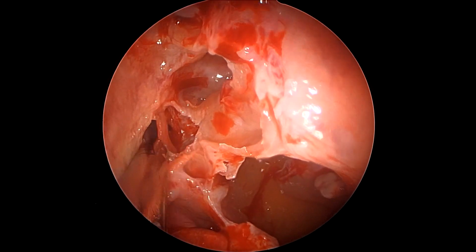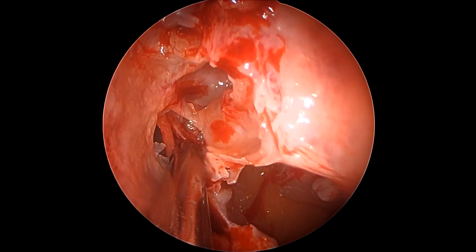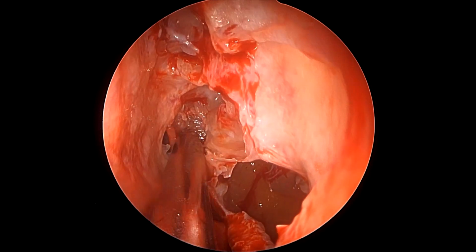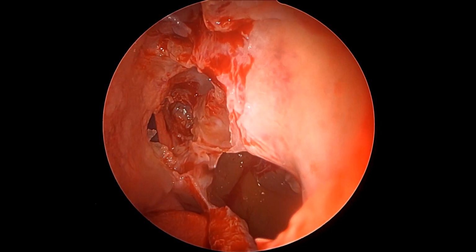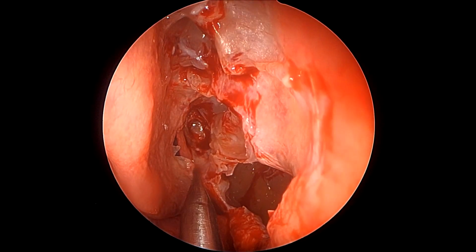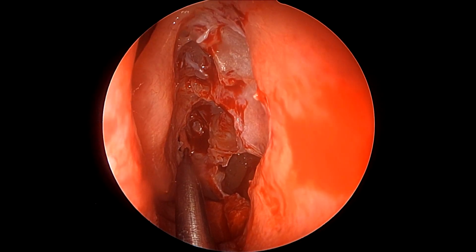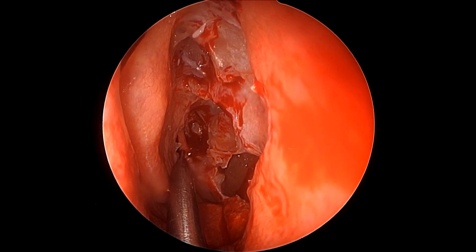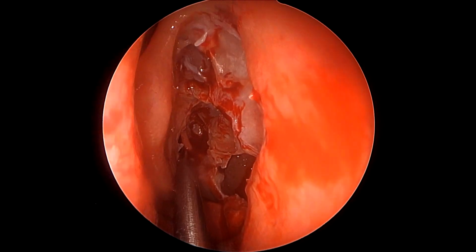Now this is the superior turbinate. It happens to be a much thinner one as compared to the right side. And we can see how the sphenoid sinus drains medial to the superior turbinate through the sphenoethmoidal recess, and the posterior ethmoidal complex drains lateral to the superior turbinate. Just like last time, we shall be removing the inferior half of the superior turbinate to make our access into the sphenoid sinus. Once again, the navigator probe correlates the presence of the superior turbinate intra-operatively to the pre-operative CT scan of the patient.